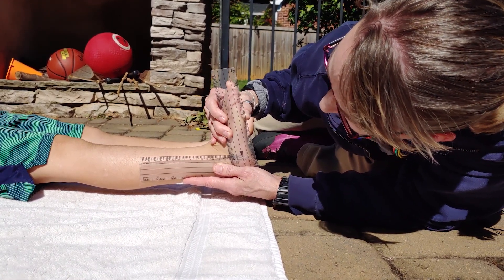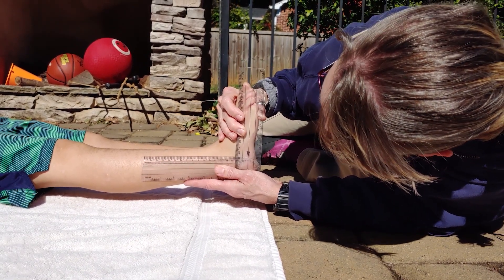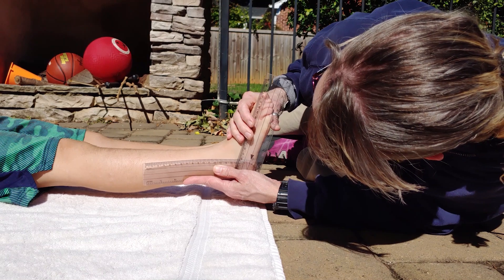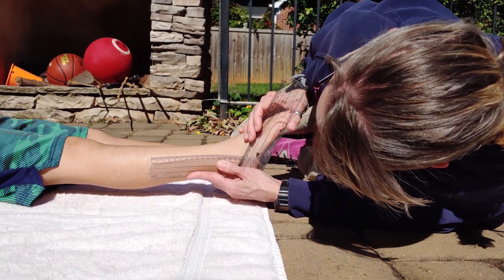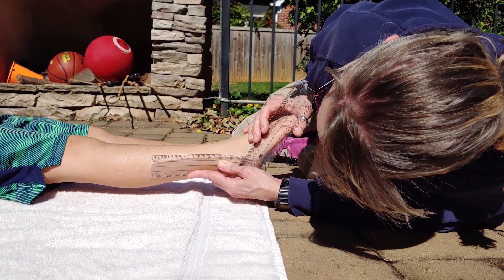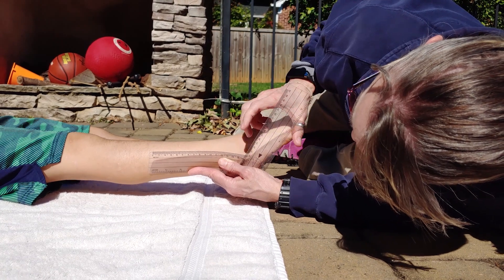The other direction where your foot goes down is called plantarflexion. From neutral, you should have 45 degrees. Let's see how far this foot goes down. That's 10, 20, 30 — and it looks like I'm starting to get more forefoot plantarflexion.